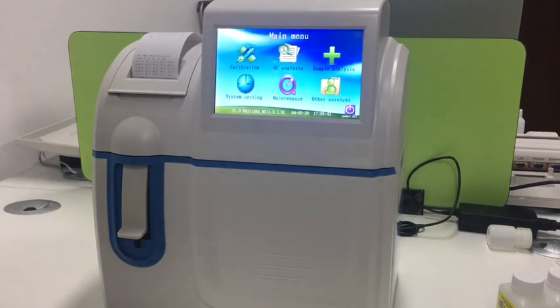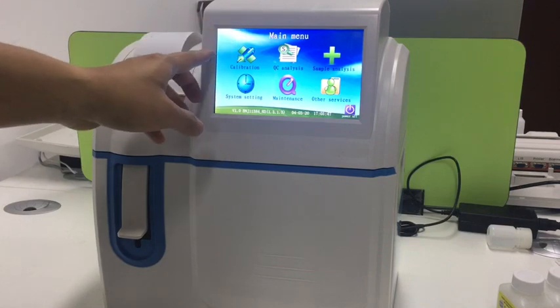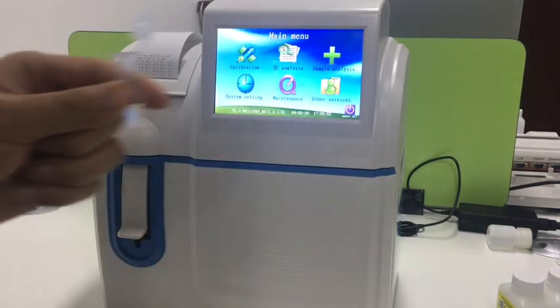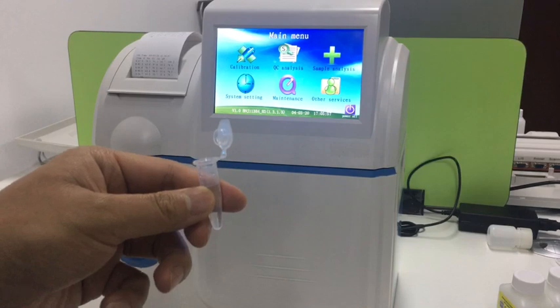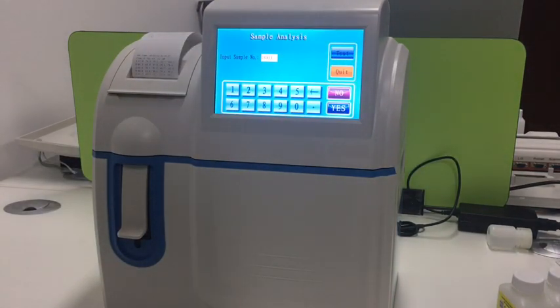After calibration, it will enter into the main menu, and then we can do sample analysis. Just press here. Here we use the QC solution as the sample to do the demo, so press sample analysis.